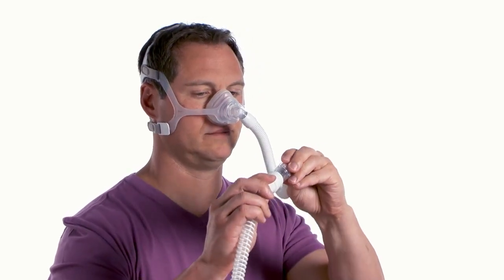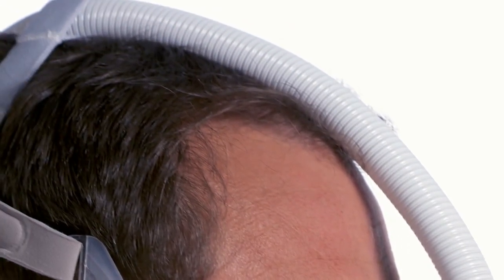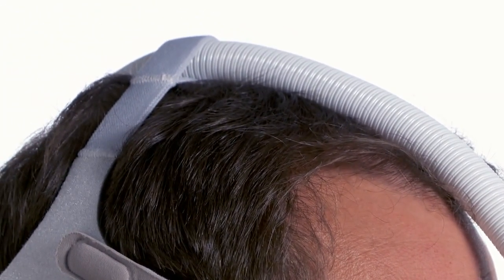Connect the Wisp tubing and elbow swivel to the front of the mask, then connect it to the flexible tubing that came with your CPAP device. Wisp also allows you to position the tube over your head — simply slide the Wisp tubing through the headgear crown loop before attaching the flexible tubing.